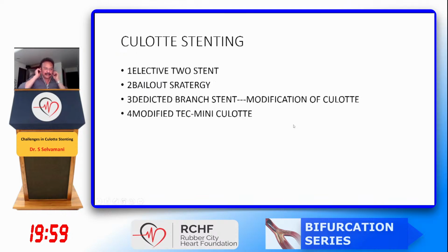A week back, Deepak called me and said, you want to show us some complex bifurcation cases. So on that, I have a few cases we will discuss. I'll try to show 2 or 3 or 4 cases, and we'll have a good discussion there.